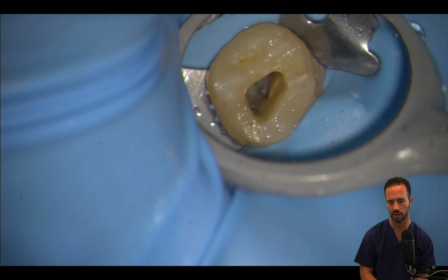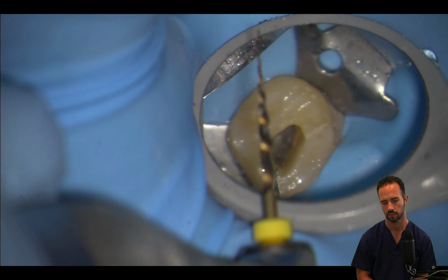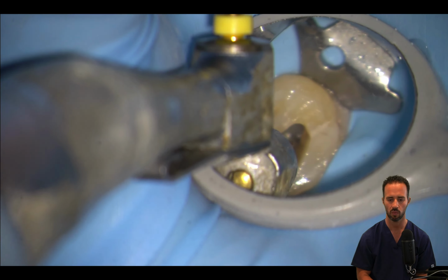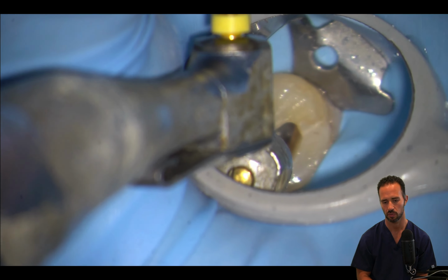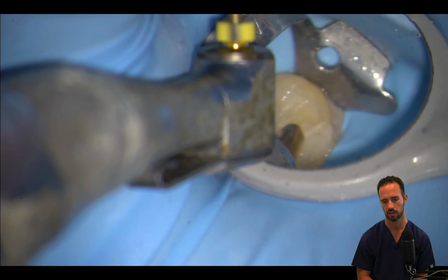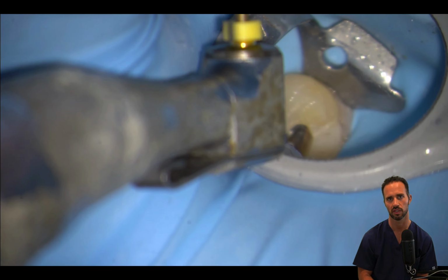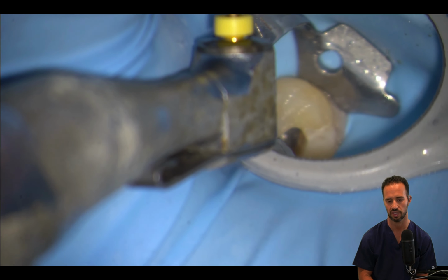And you can see that crevice there. I paused it here so you can see there's very little to no dentin covering the floor of the pulp chamber at this point, and we're starting to feel really confident that there's not an MB2 present. So we're just going to try one more time with our orifice opener, pecking in that area. And nothing. We're running into a solid block of dentin.